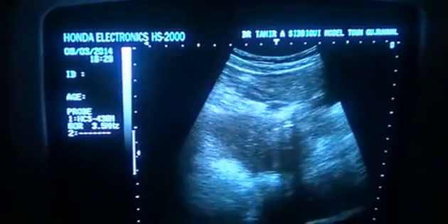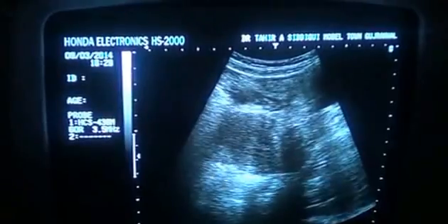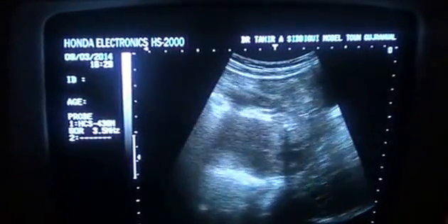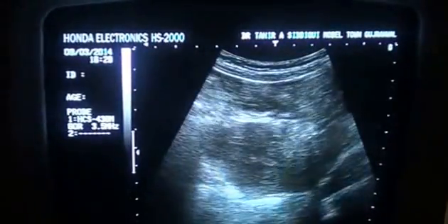This is the same patient, but now post-micturition. We will evaluate the uterus and the pelvic organs post-void, which should be done in every patient to definitely rule out its relation.